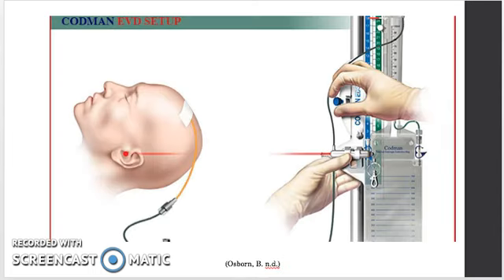So many ventriculostomies are equipped with a laser pointer, so you can actually point at the level of the patient's tragus. At UW, the ventriculostomies that they use do not actually have a laser, so it's really up to the nurse to eyeball where the patient's tragus is and where the transducer is.